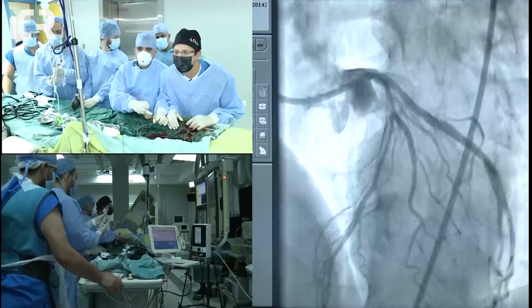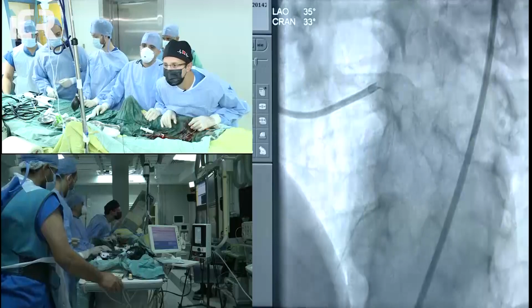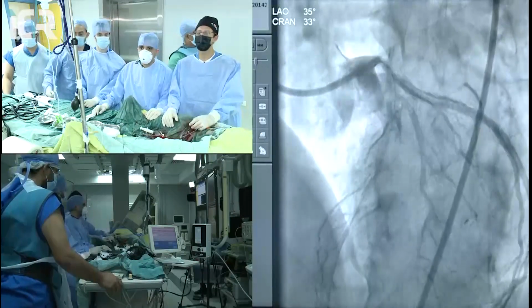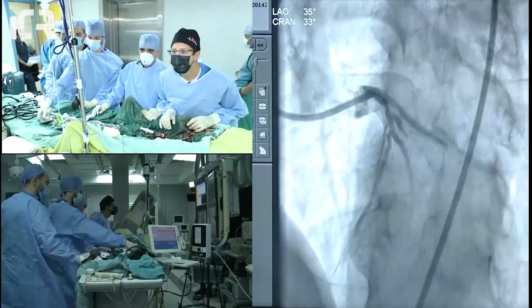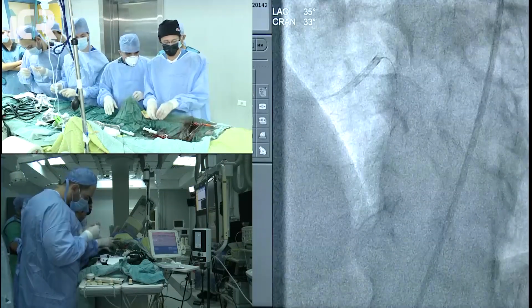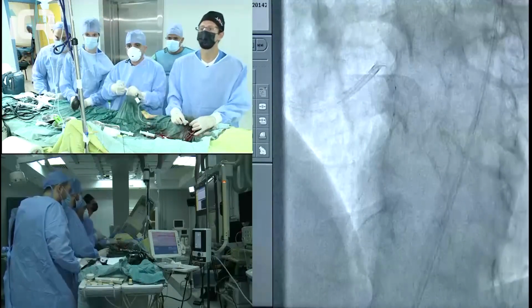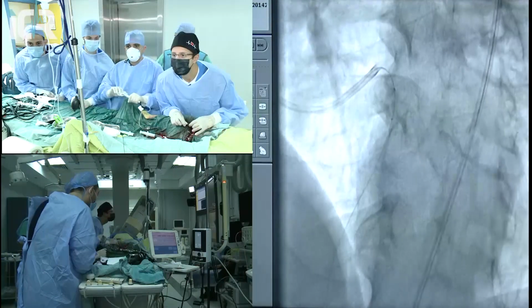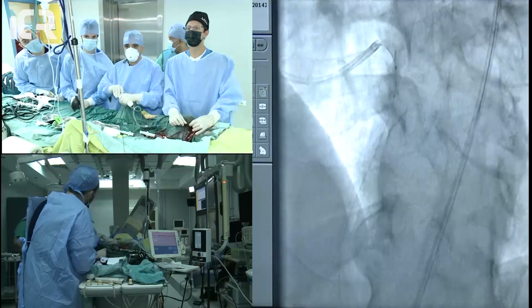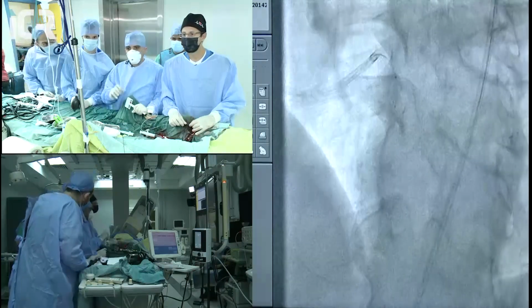Picture now. The diagonal looks good. Distal to the stent is black, but it's okay. I think we can leave it like that. Okay, now the 3.0 balloon passed, and we'll crush this diagonal stent. I appreciate that this balloon is fully open.